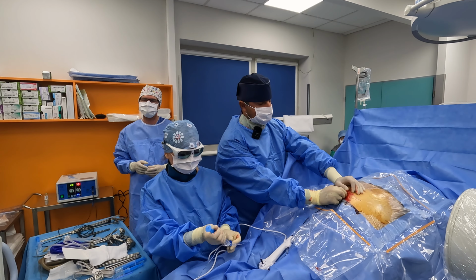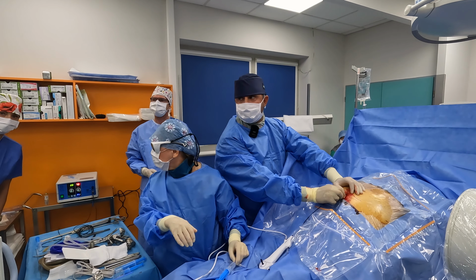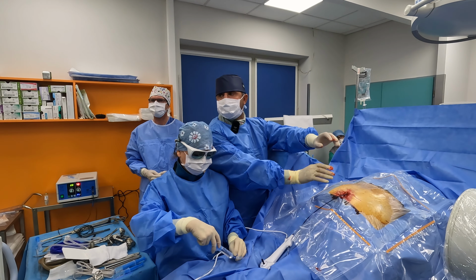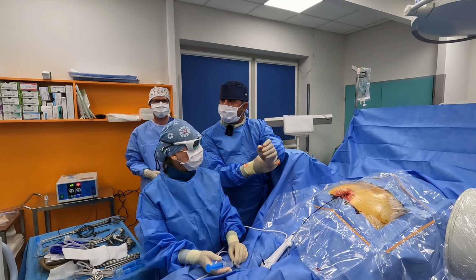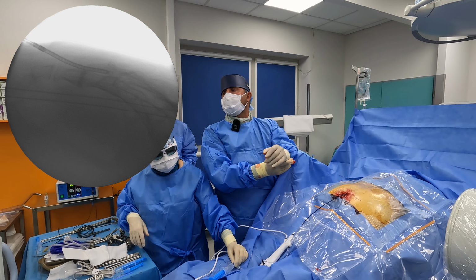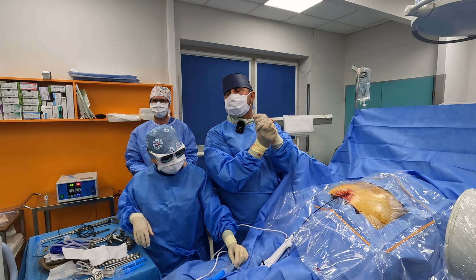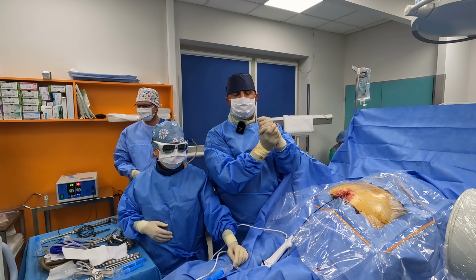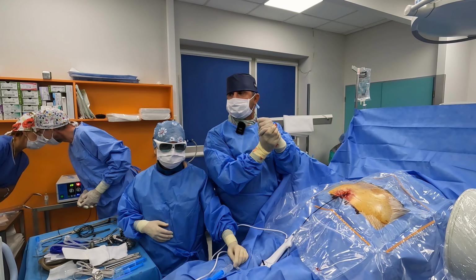So as I said, we are going inside in a lateral position with the epiduroscope, and we are just going to the first part of the sacral canal. We're checking in a lateral position, we see that we're okay. Now we know where we're going. We would like to go maybe above the L5-S1 disc, or mainly even up to the L4-L5 disc herniation.